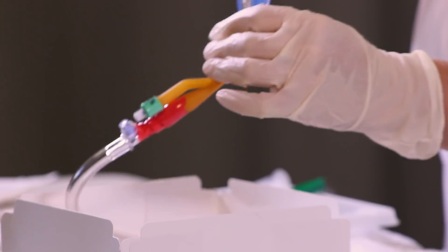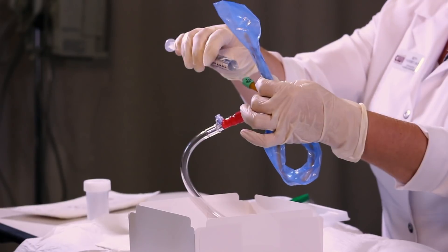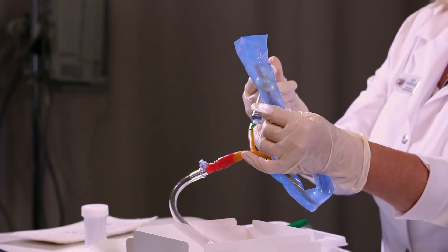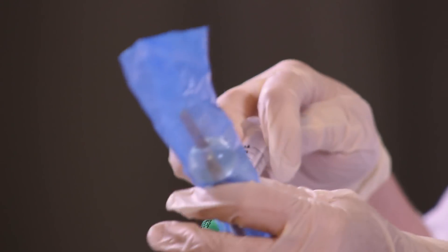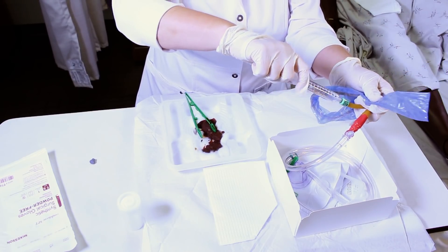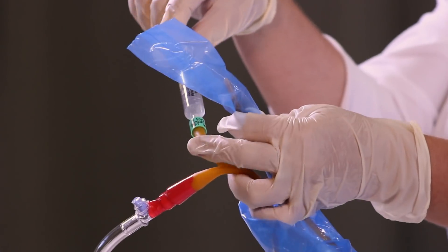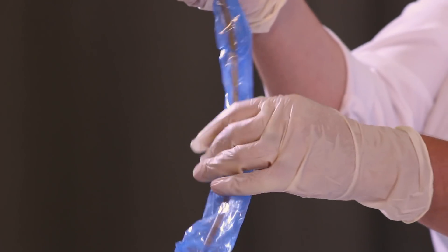Then we look at our catheter. This is the part that will be inserted into the patient, and there's a balloon on the end. What the balloon does when it's inflated is it keeps the catheter in the bladder and keeps it from being pulled out. Depending on your facility policy and manufacturer recommendations, you can test the balloon to make sure it inflates properly — inject all 10 cc's of fluid, make sure it inflates and there aren't any holes or leaking. After deflating the fluids, I can lubricate the catheter and leave the syringe with all the normal saline still attached to the port so we can inflate it once the catheter is inserted.